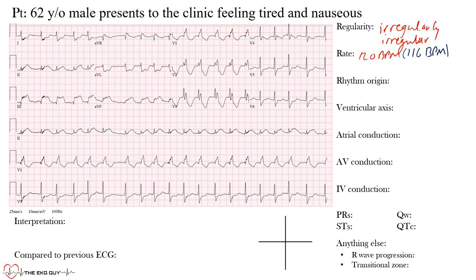Now, where is the rhythm coming from? The next portion is rhythm origin. Notice that the QRS complexes are somewhat wide. Normal QRS duration is less than 120 milliseconds — actually between 70 and 110 milliseconds — but here the duration comes out to 136 milliseconds, so there may be some conduction delay within the ventricles. Also, there are no clear P waves preceding the QRS complexes.